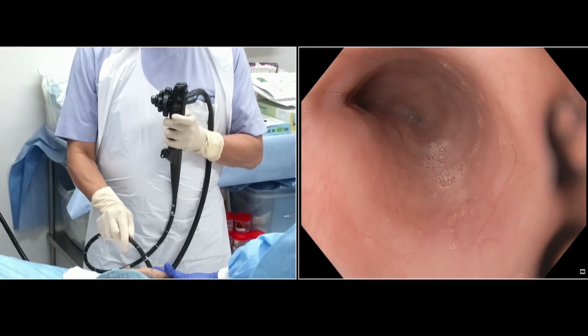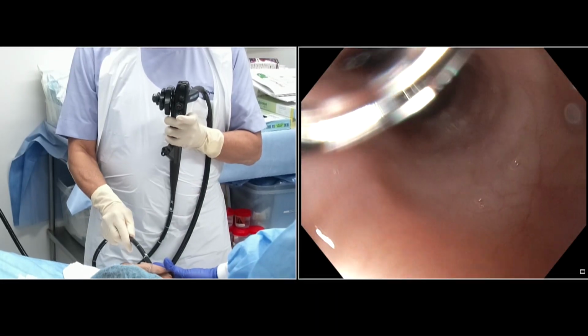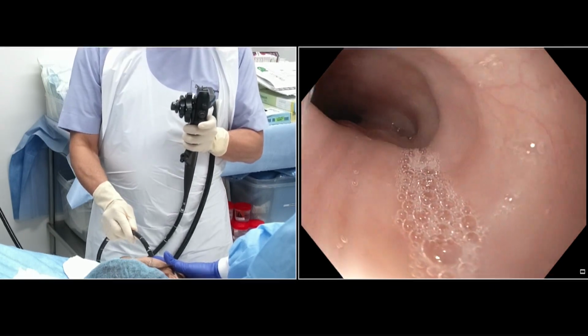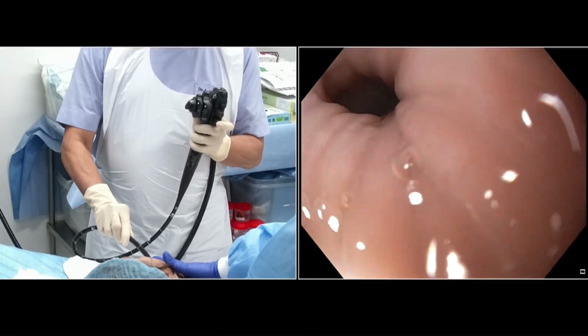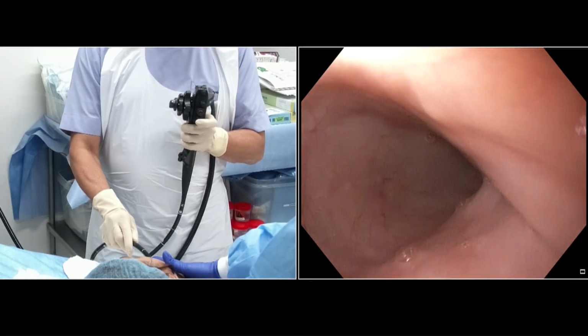You start studying the mucosa. You also see whether there are any peristaltic waves. You can see that intermittent peristalsis is happening in the esophagus. So that means this esophagus has got a normal peristalsis. I keep on going along by turning the shaft. You can see below at 12 o'clock position there is a bulge. That is the bulge of the spine.